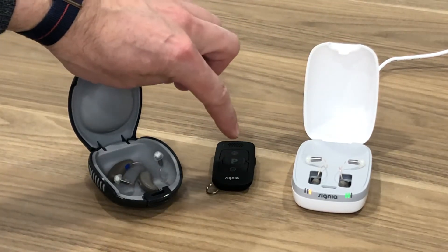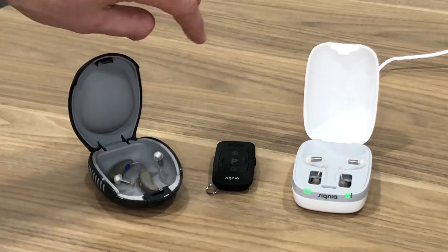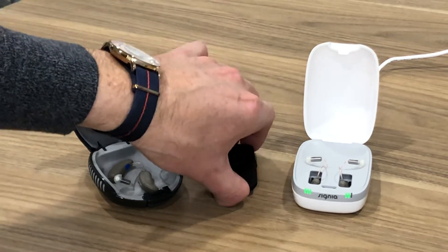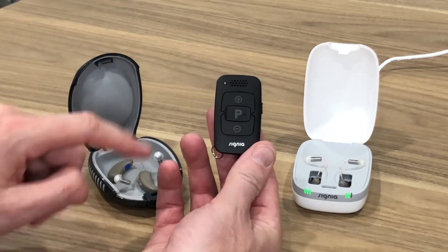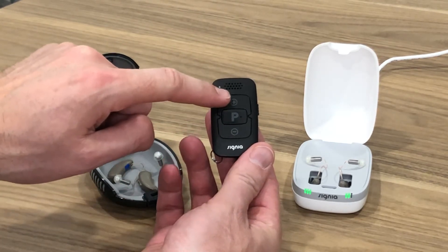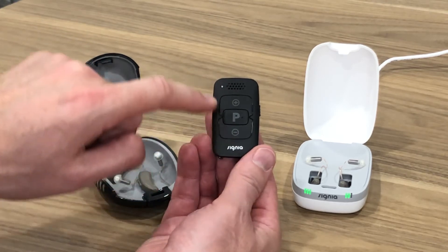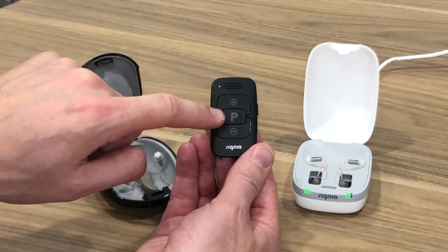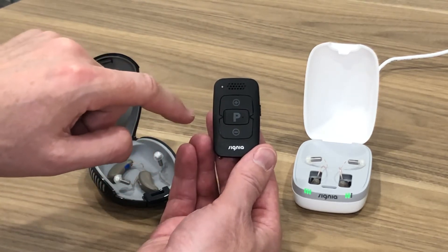In between we have a remote control. This remote control can control the Signia products — it's a nice little remote, fairly simple to use. On the remote we have a plus which turns up the volume, a minus that turns down the volume, and in between there's a program button with a P written on it that allows people to change to different programs.